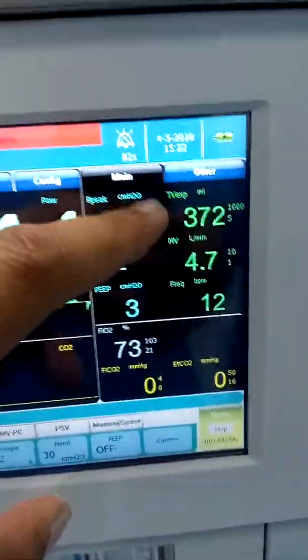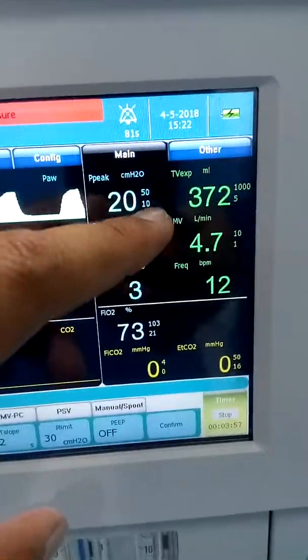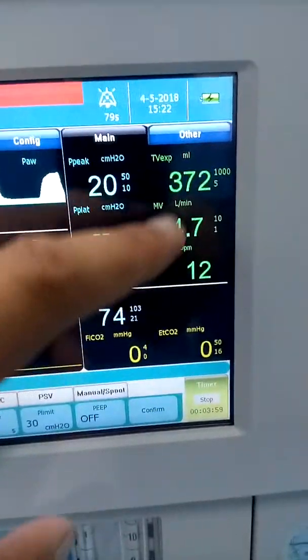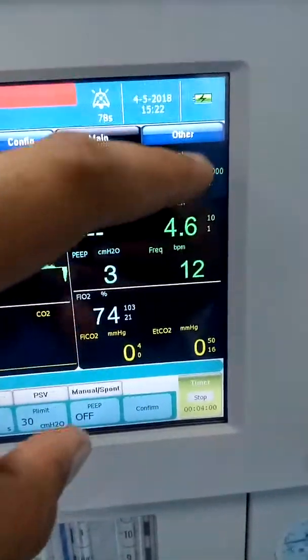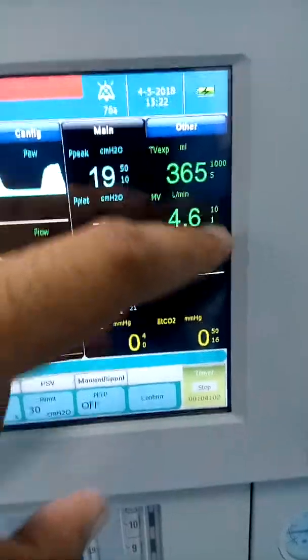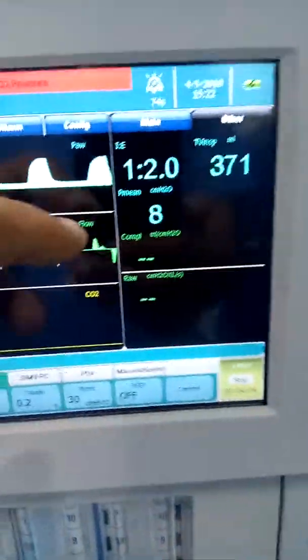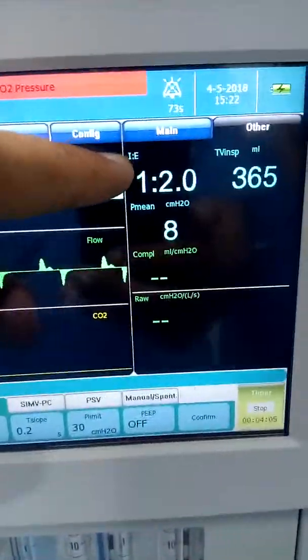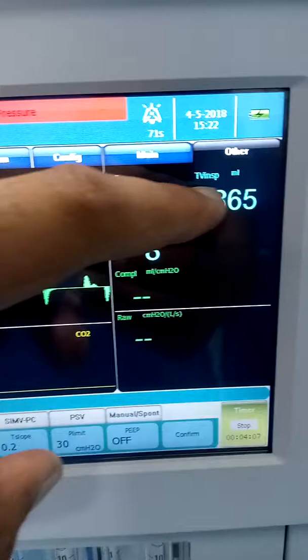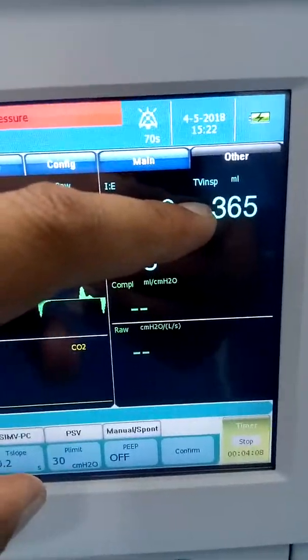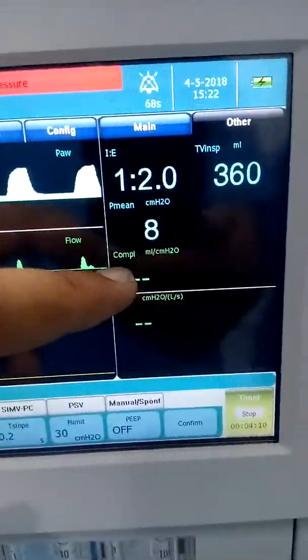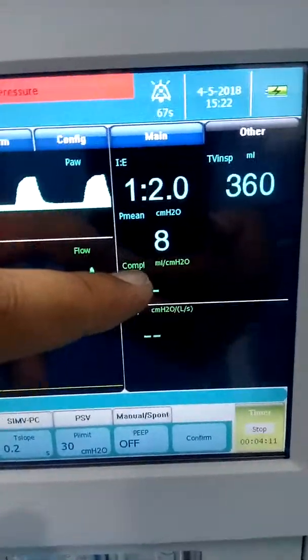Tidal volume, expired minute volume, and frequency are displayed here. These are alarm limits for the parameters. In the other section you can see IE ratio, inspiratory tidal volume, and compliance.